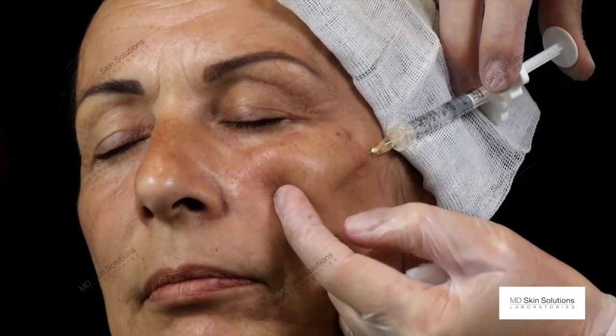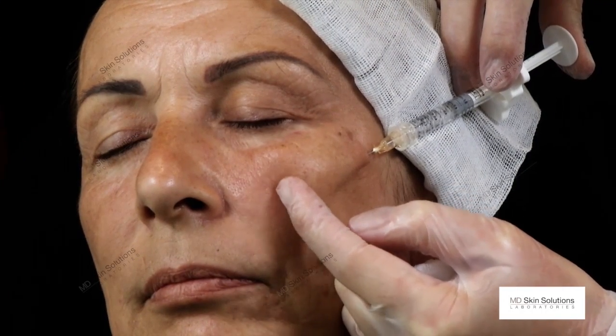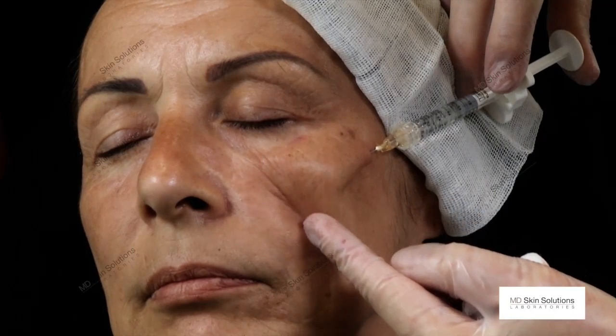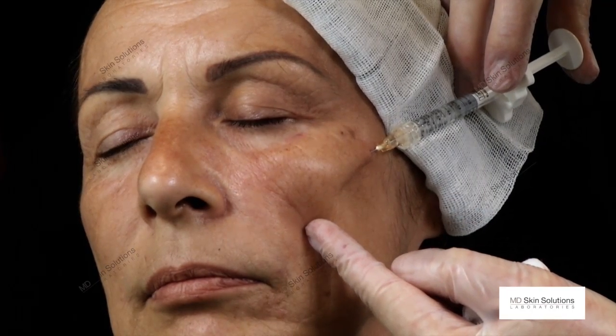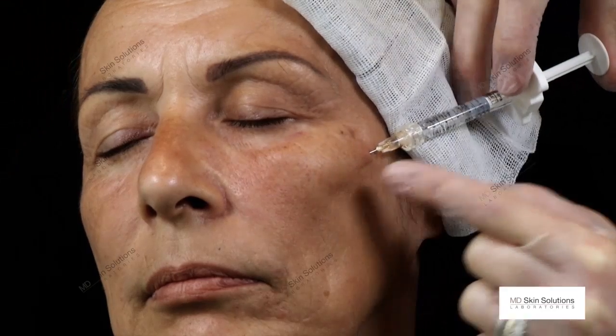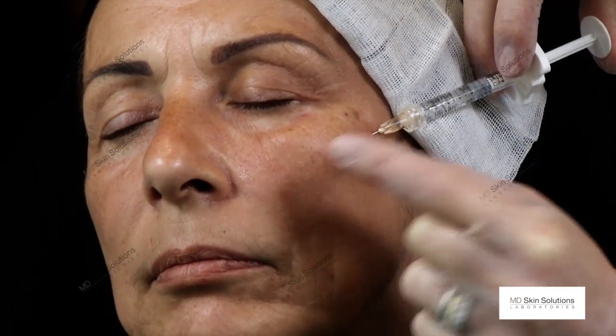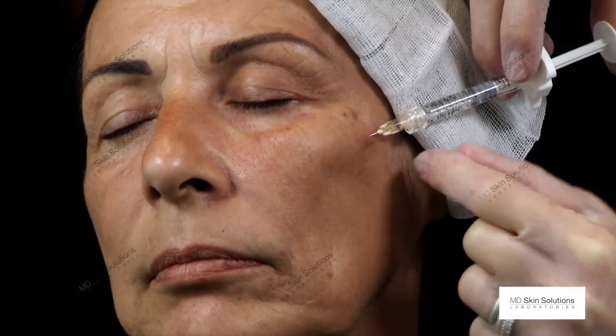Next rule is control where the tip is. When it sits exactly on this nasojugal groove, then we are on the right level or area, and level wise we're down on the bone.